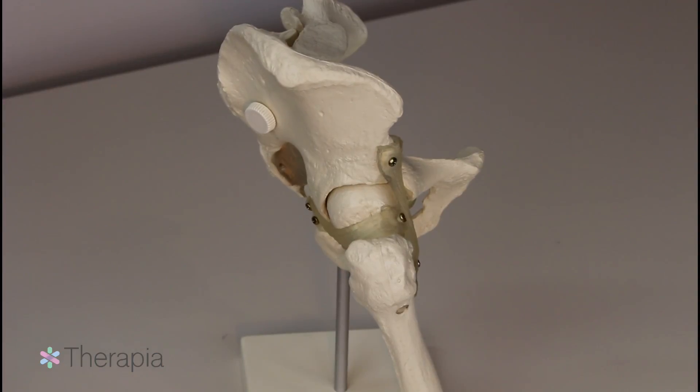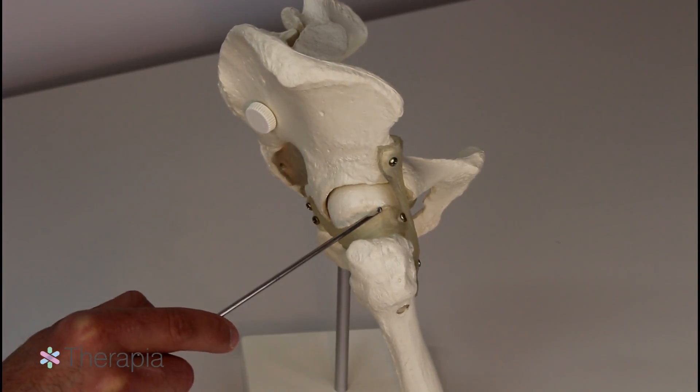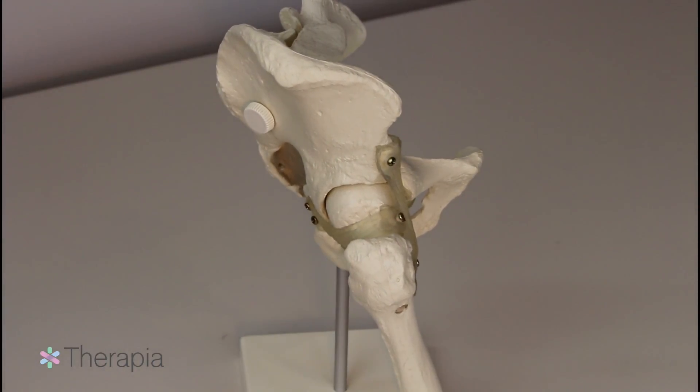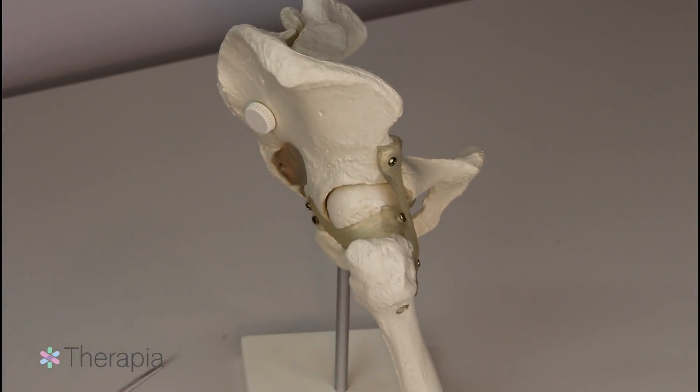Hip osteoarthritis results in wear and tear on the bony surfaces of the acetabulum, the femoral head, and the shock-absorbing cartilage in between. With a hip replacement, diseased cartilage and bone are replaced with prosthetic implants.